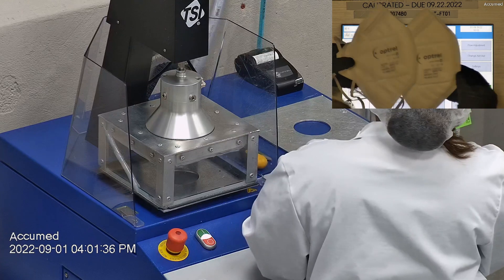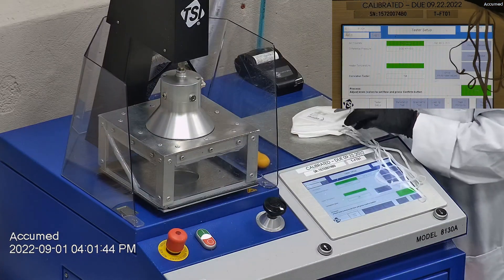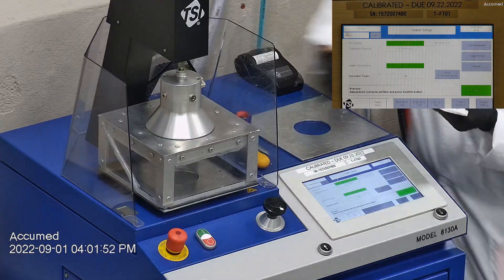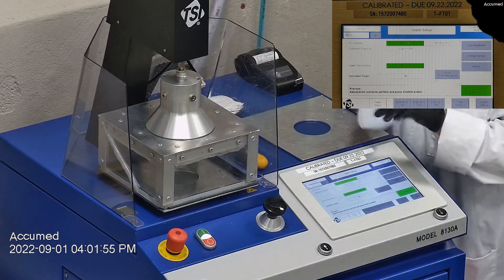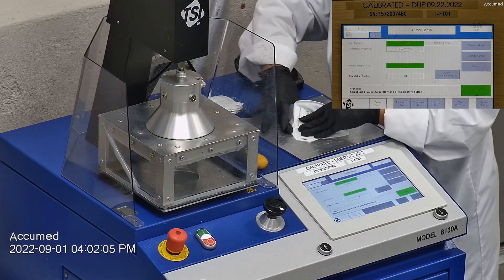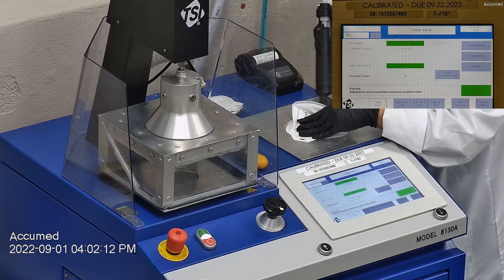This is our TSI machine model 8130A, which is also the same filtration testing machine that NIOSH uses to approve N95 respirators. Our procedure is also inspired by NIOSH. We first run a tester setup and start by removing the headband from the respirator before placing it onto the testing plate to ensure a proper seal.